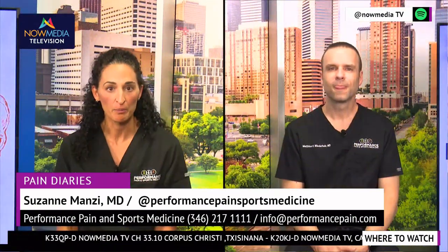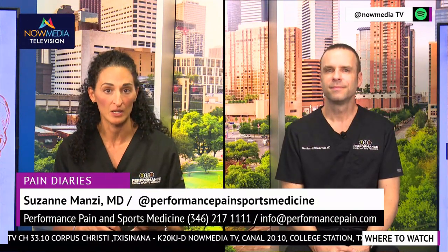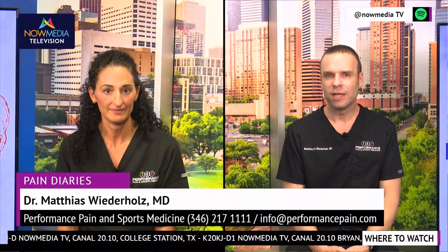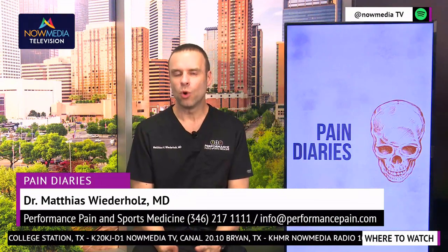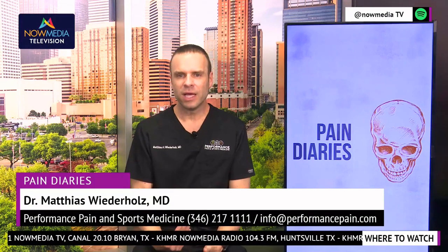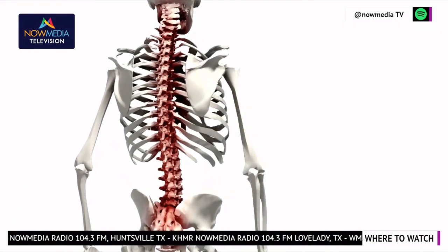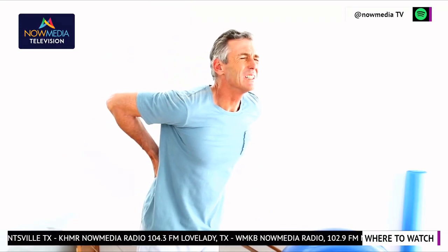So let's talk about the programming and customization options that are available with Medtronic, with this system, and how can it adapt to an individual's needs? Yeah, so there are an infinite number of programs available with the Medtronic stimulator system. The latest waveform, and we use the word waveform to sort of describe the way that the electrical impulses are being delivered to the body, that is called DTM, or differential target multiplexed. That's a very big jumble of words, but what does that mean?